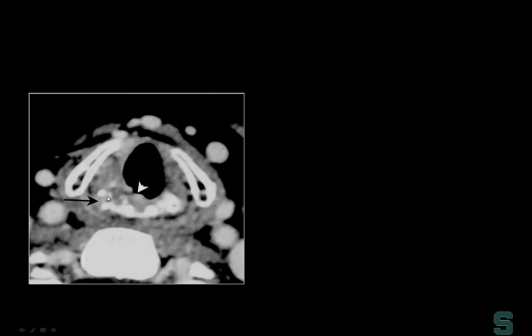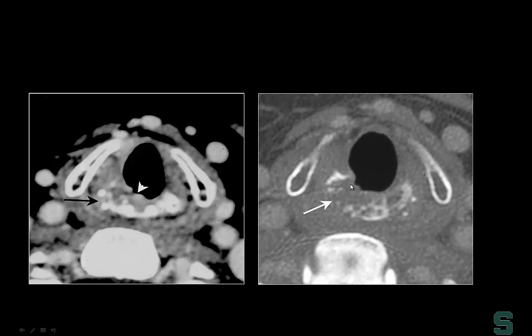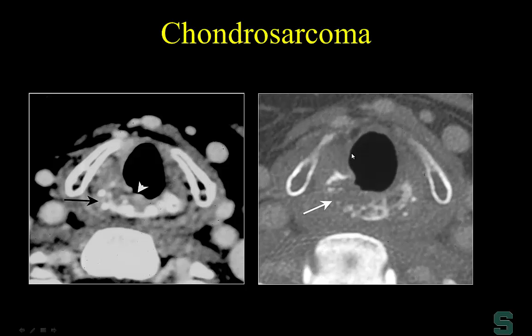Here's a lesion primarily involving the cricoid cartilage. On bone algorithm, it's not primarily mucosal — it's submucosal and limited to the cricoarytenoid joint. If I tell you there are rings and arcs of calcification here, the diagnosis is chondrosarcoma. Chondrosarcomas are actually not uncommon in the larynx. They typically present as a submucosal mass, and surgeons describe them as rock hard when they inspect the mass.